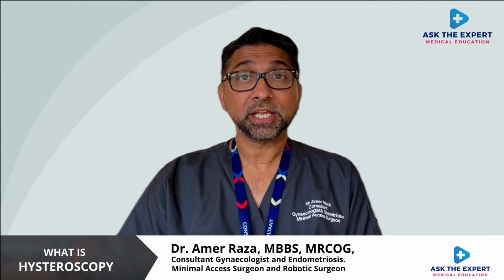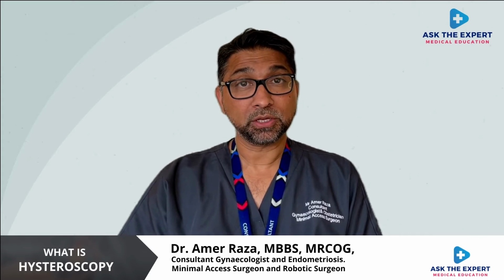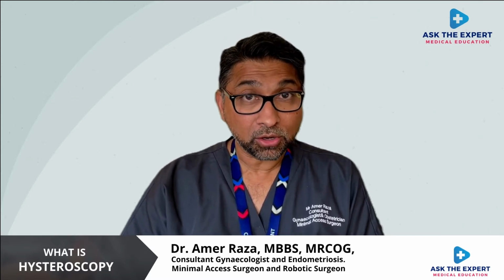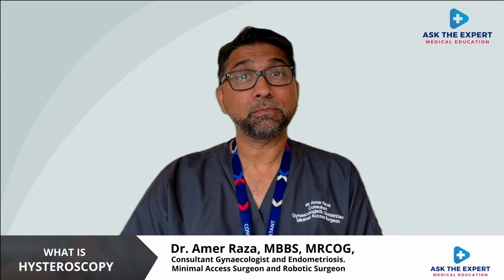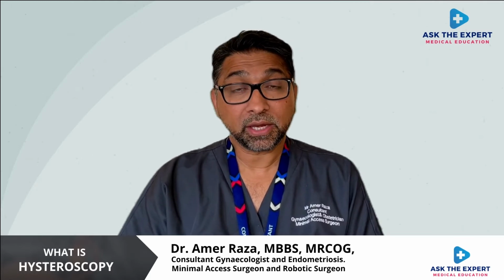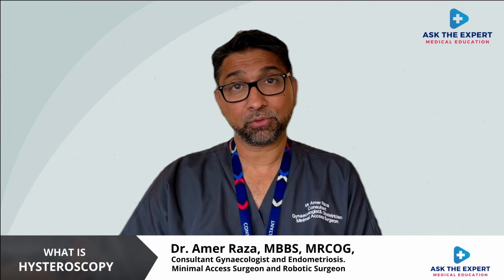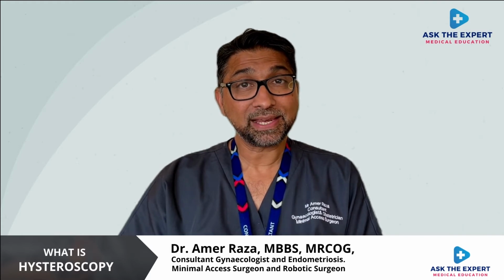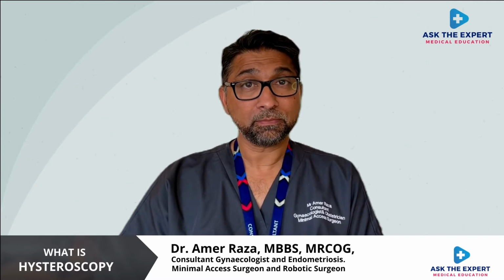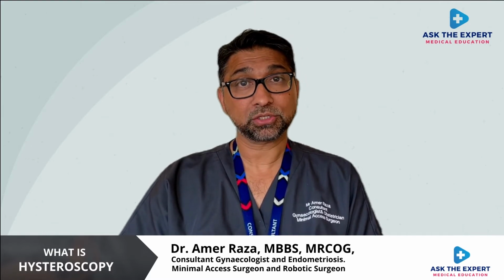Hysteroscopy in an outpatient setting is part of a diagnostic workup for irregular bleeding, postmenopausal bleeding, to rule out the possibility of endometrial cancer, and also to treat small uterine pathologies such as removing an endometrial polyp, removal of an intrauterine contraceptive device or a Mirena intrauterine system, or even to do endometrial ablations and remove small fibroids. There are a few key salient features for outpatient hysteroscopy. I will now explain how it is carried out, and what you need to know before having an outpatient hysteroscopy.